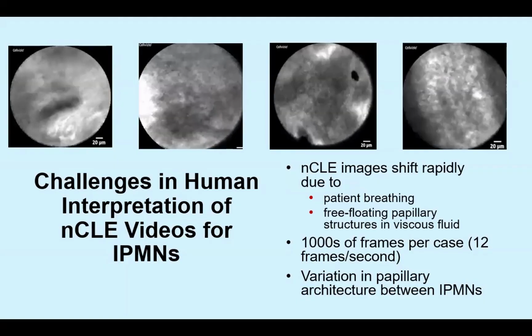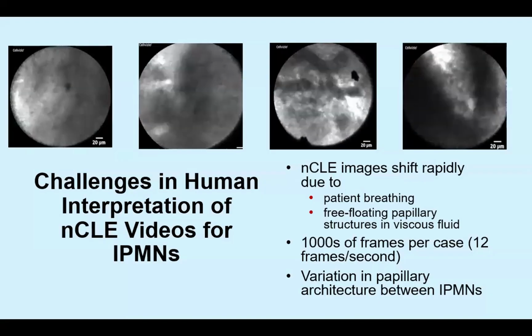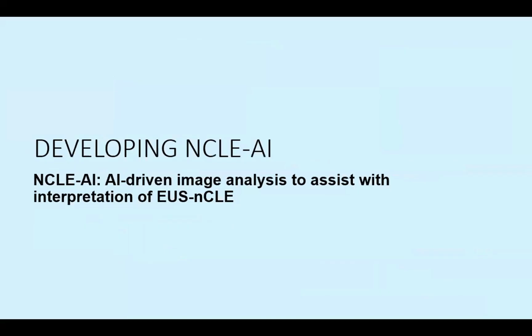You may have to pause the video, scroll frame by frame, and then get to understand the dysplasia. But as you get to do more cases, when you're doing the case, right after the case, you will know whether this is low grade or high grade. But for now, because of these problems, we developed the AI model.